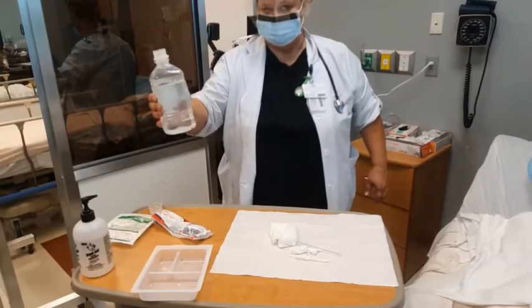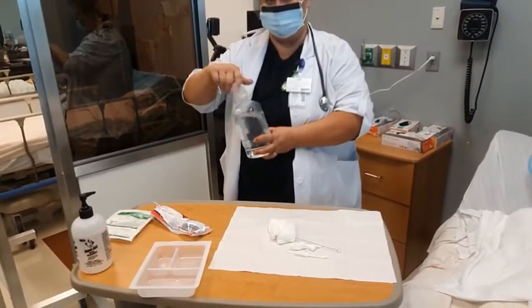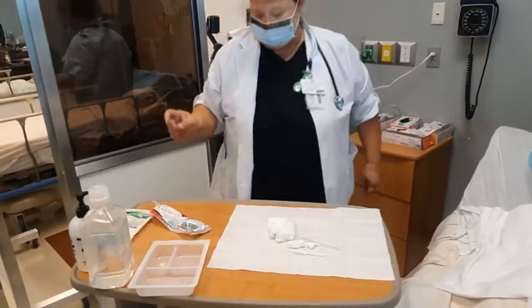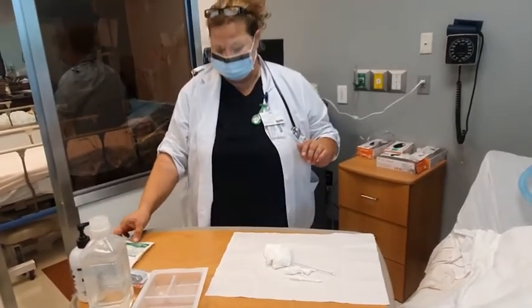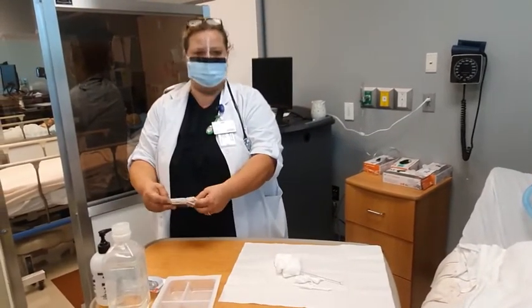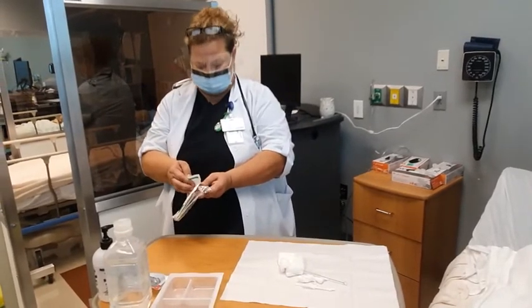If it spills all over the table, make sure you clean it up because it can actually contaminate the drape that you have down. Now you will don your sterile gloves wherever you have enough room. So, you know, you don't want to be over here on your sterile field. So I have this space here that I can actually open up the gloves. And if you don't think it's enough space, you can move to the chest of the patient as long as you do not contaminate.